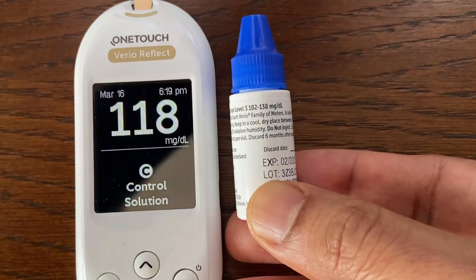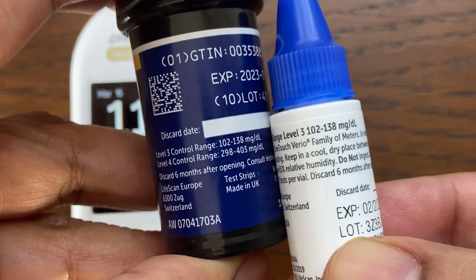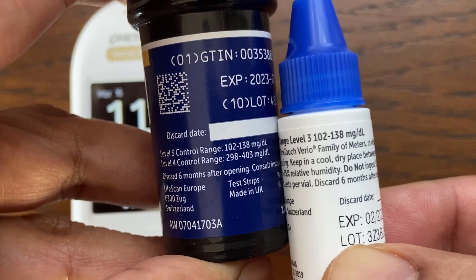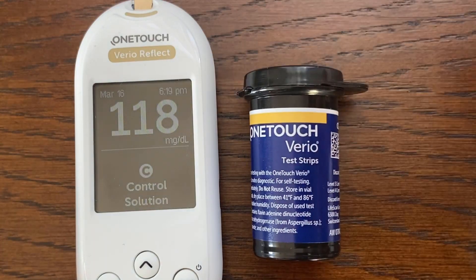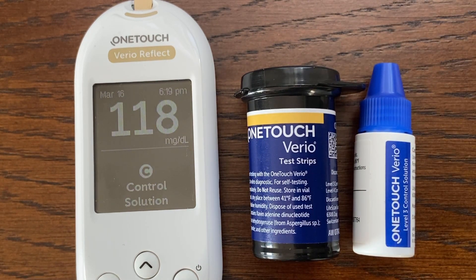The reading obtained is 118, which is within the range. The control range is also printed on the test strip bottle. If your control test result is out of range, do not use the meter for blood glucose testing and contact customer service to resolve the issue.